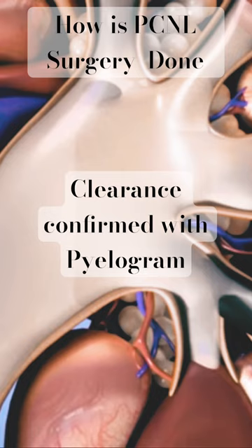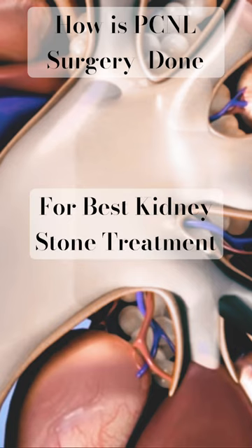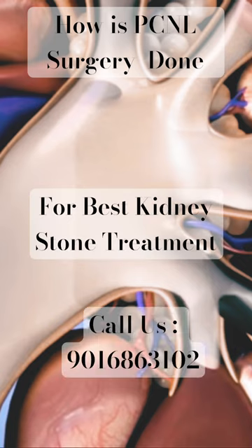In some patients, a temporary small tube called a double J stent may be placed to ensure that swelling does not block the drainage of the urine. The stent remains in place by J-shaped curls in both the kidney and bladder.